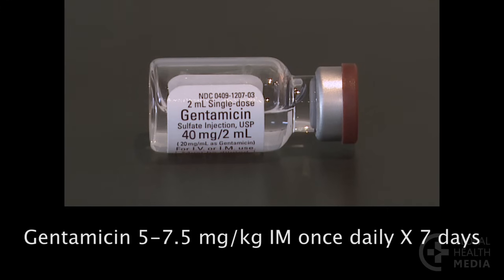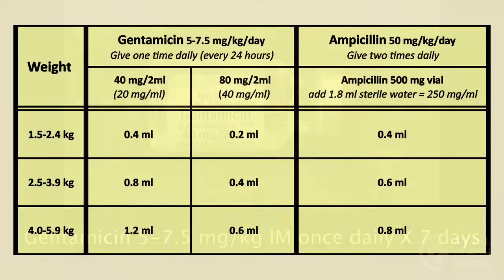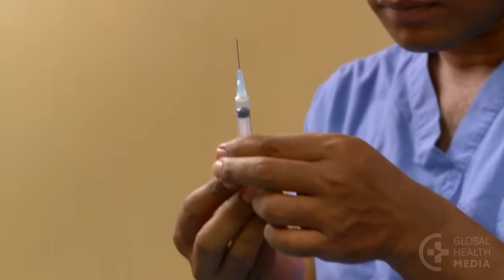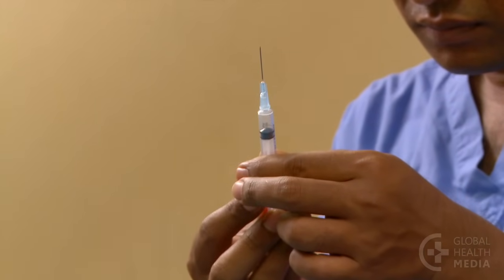Check that the medicine has not expired. Then determine the baby's dose. The preparation of gentamicin is 40 milligrams per two milliliters. Using the dosage chart, our three-kilo baby needs 0.8 milliliters once daily. Now draw up the medicine — first draw air into the syringe equal to the dose you need.